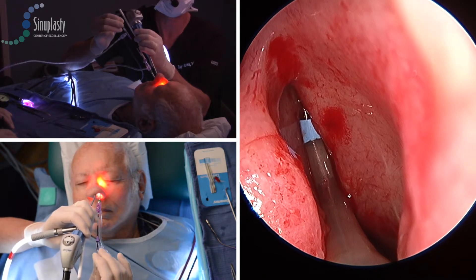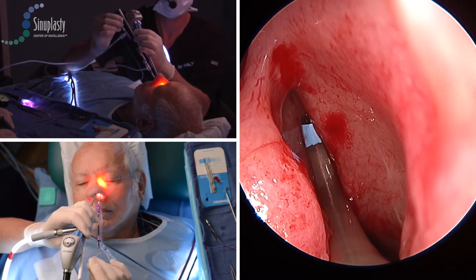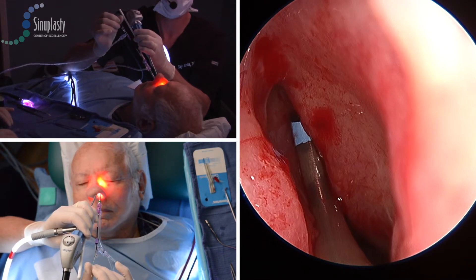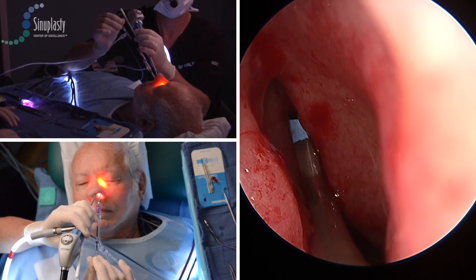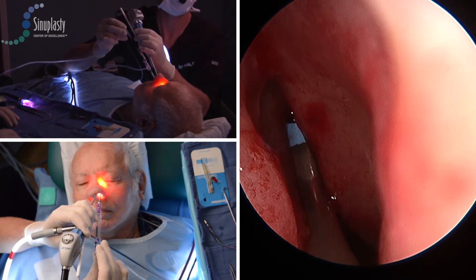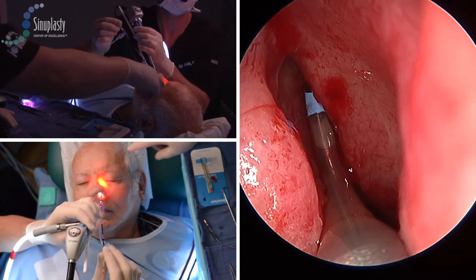You can see that the distal portion of the guide is placed well inferior to the crotch of the uncinate and the middle turbinate, allowing a full search pattern to be obtained. If the wire axis is not obtained initially in a direct superior fashion, then we will move the guide a little bit laterally behind the uncinate process to allow a different search pattern to be obtained.